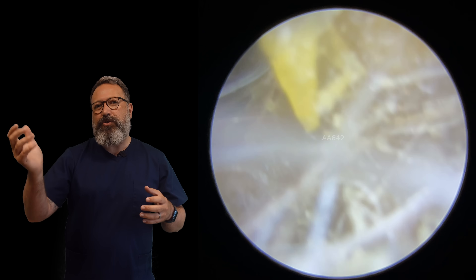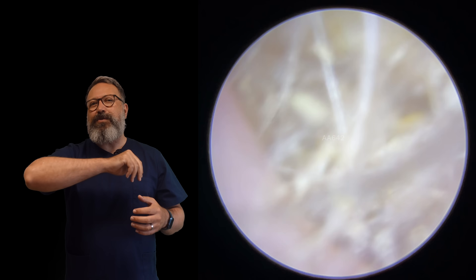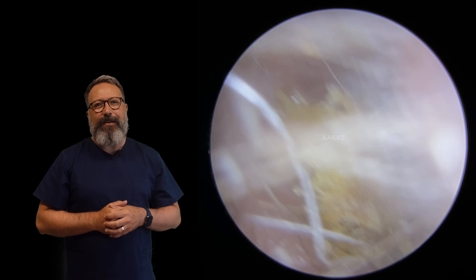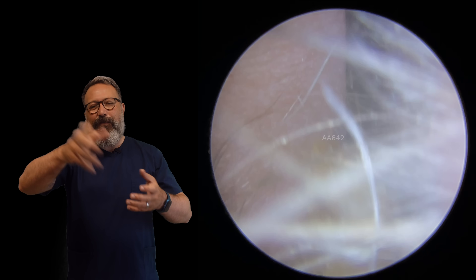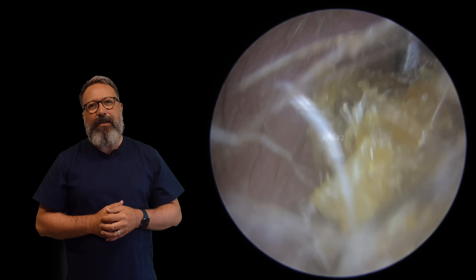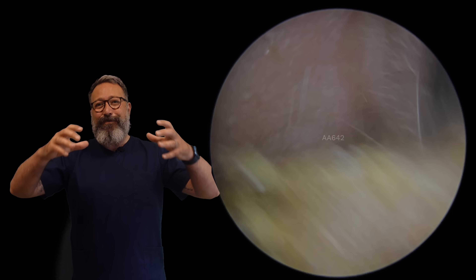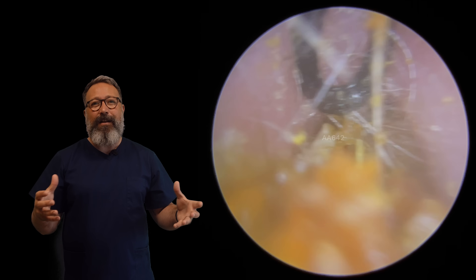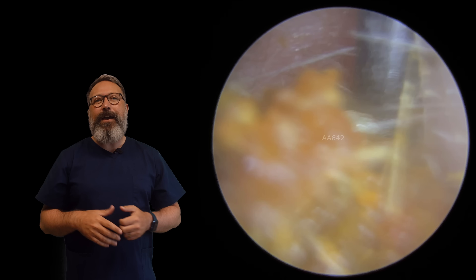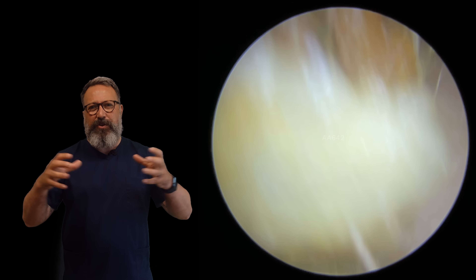We're detaching those harder bits of wax on one side, then dropping over the top. Keep your eyes peeled for this one — just dropping over the top and starting to pull this through. Look at that one starting to come away. We've managed to pull it — flicked off the top. Going back in now, just hovering around that outer part of the ear canal. Look at that coming away — that is the section we could see on the outer part of the canal, but that is not all — there's more in there.